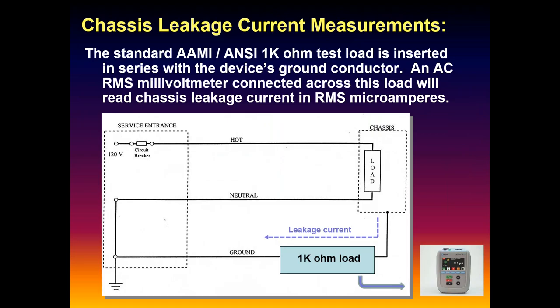And this is the standard answer. You know, Amy must have spent at least 5, 7, 8 years, sometimes back maybe in the early 70s, 80s, before the standards came out, chasing these little leakage currents all around. Our whole professional mindset was consumed with these. We were plotting this stuff out, tracking it, writing it all down, trending it and graphing it. I called it a lot of mental masturbation.